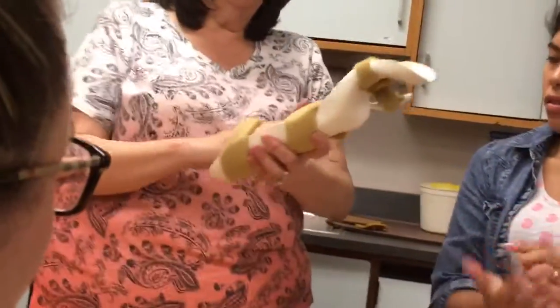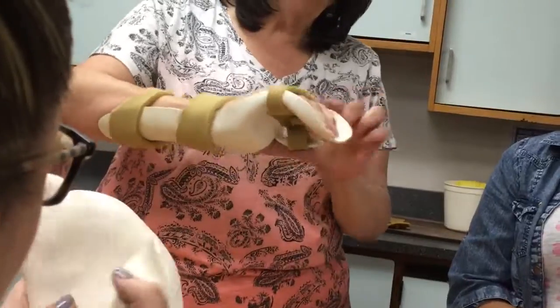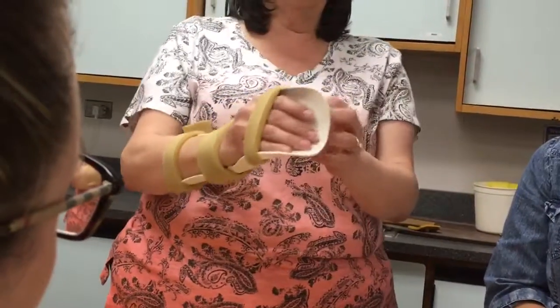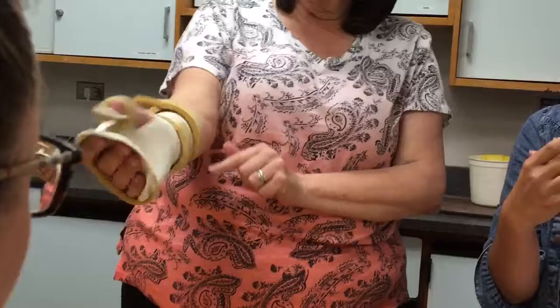Do you see this nice well for my fingers here? You see how it starts my fingers from going off the sides? You see how this is curved over here a little bit?